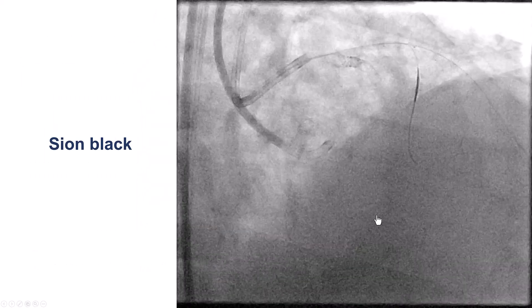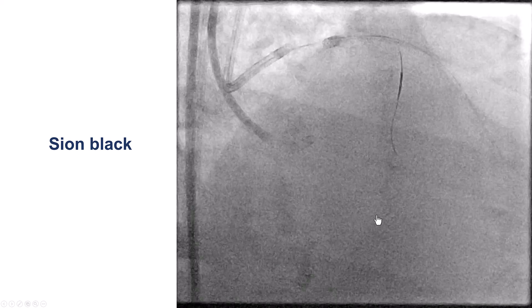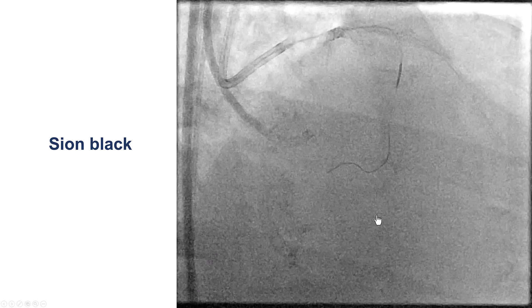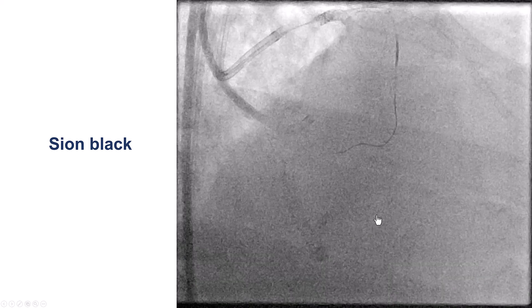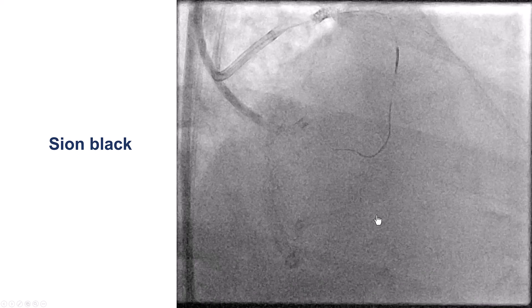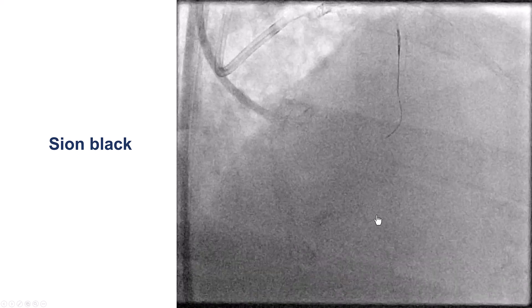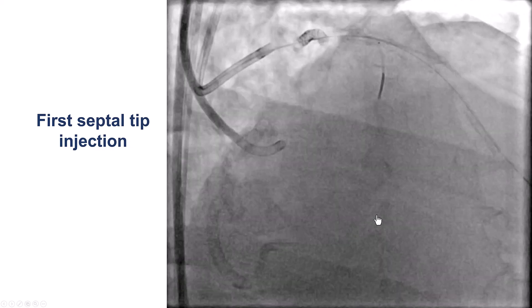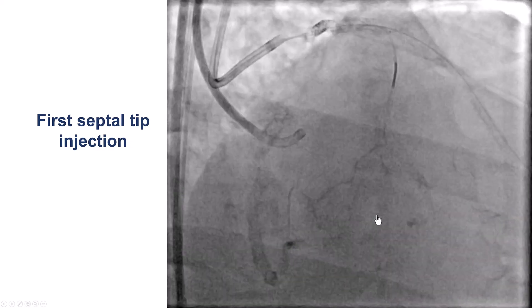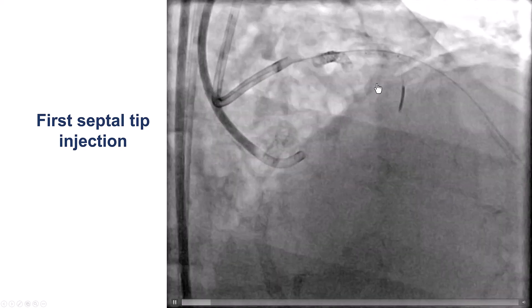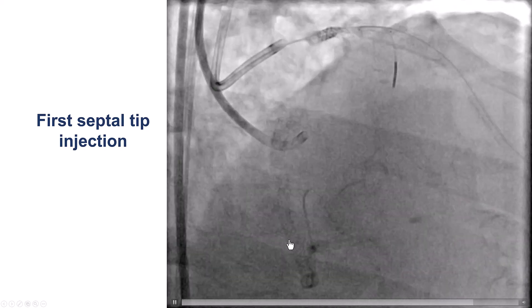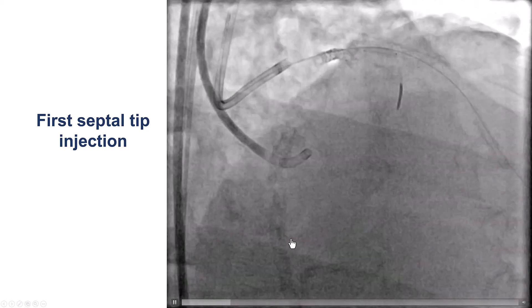We first tried to go retrograde. We advanced a microcatheter into the first septal and tried to do surfing with a Sion Black guidewire, which unfortunately did not make it down to the PDA. It was making some progress, but then could not be advanced any further. So after we tried for a few minutes, we decided to perform an injection to better understand the course of the collateral. We can see here that there is a very tortuous course with multiple bends, and then eventually this collateral comes all the way to the right posterolateral.